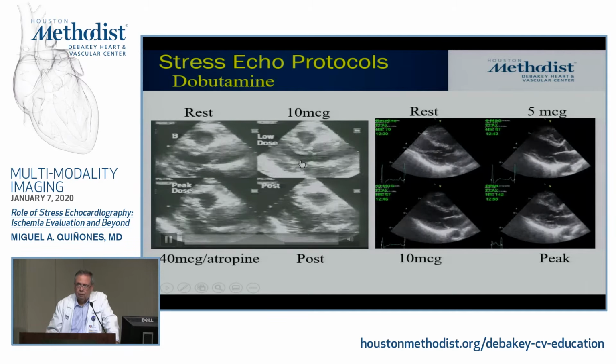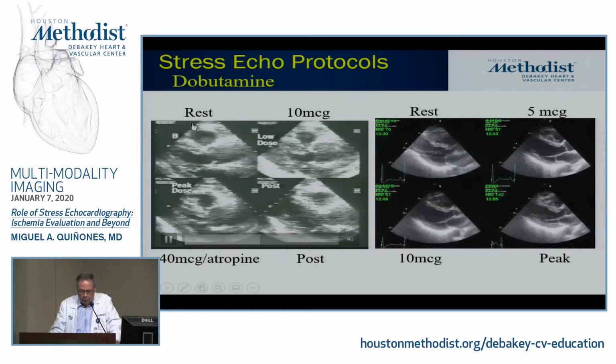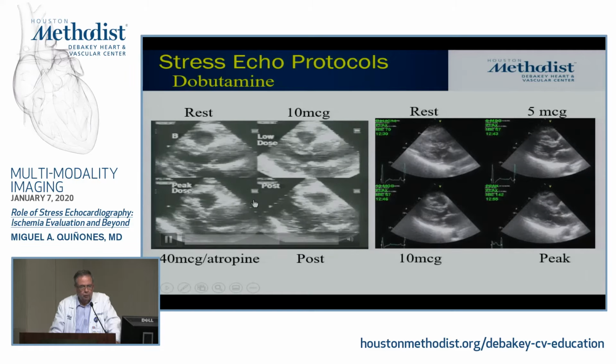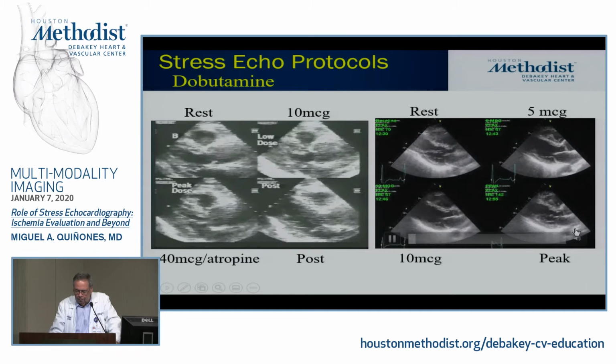Now, there are two kinds of protocols that labs do. This is one very commonly used. For the quad screen, they put a resting, a 10 mic, a peak dose, and a post. Very commonly done by people. We tend to do resting, 5, 10, and peak.